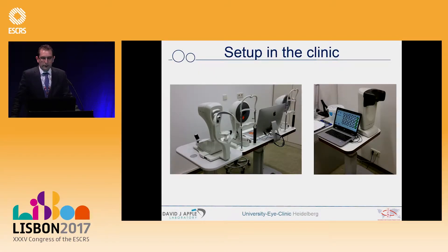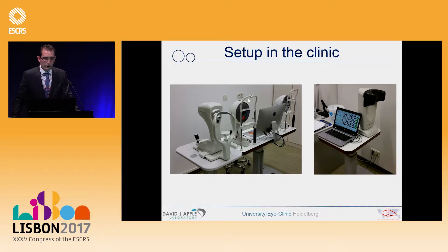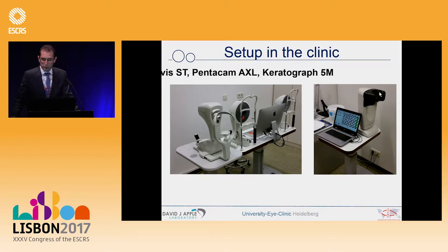This is the setup in our hospital. You can see on the left side the Keratograph 5M from Oculus together with the new model Pentacam AXL in combination with the Corvus, and on the other side the Binoptometer 4P.